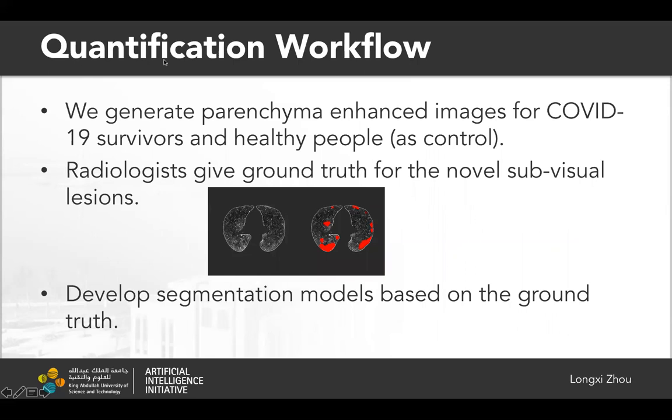And then we quantify the local CT lesions. We first generate parenchyma enhanced images for COVID-19 survivors, as well as healthy people as control. And then radiologists will give ground truth for these novel lesions like this. And we then develop segmentation models based on these annotations.